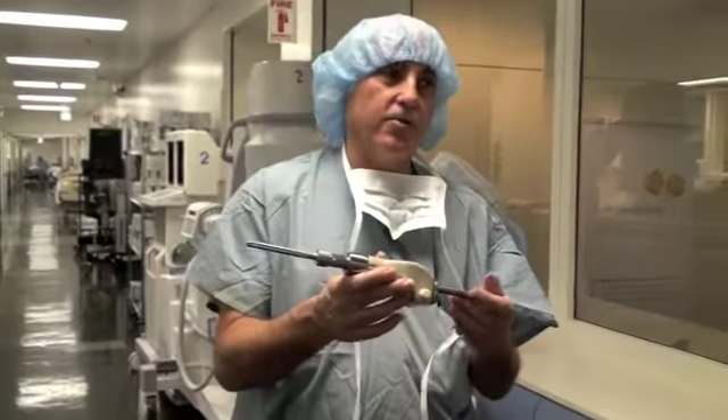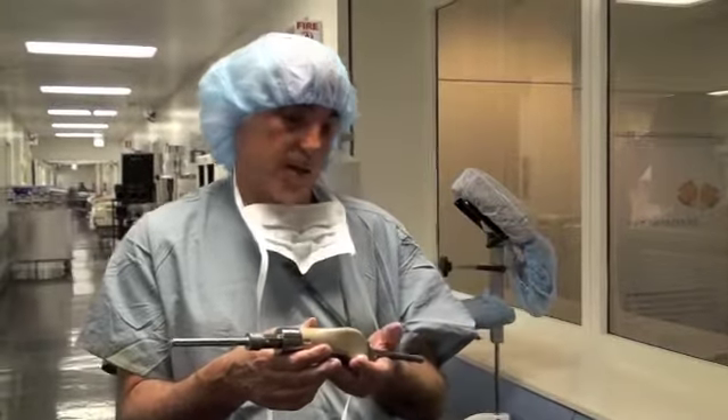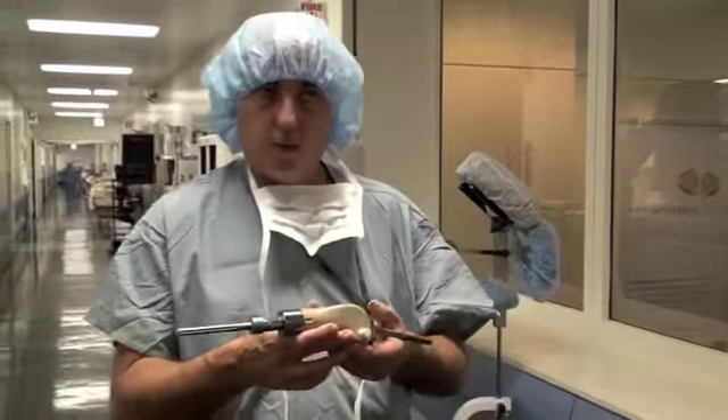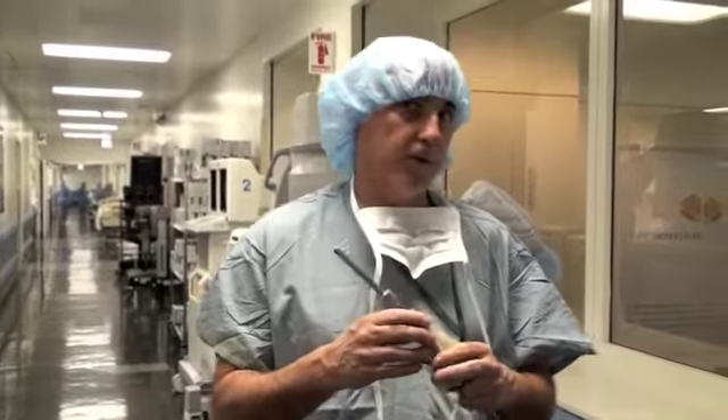This is a pediatric device. It will serve its purpose until he stops growing, and then we put in an adult device, which is more durable, stronger, and more suited to a grown-up individual. It's a very rare operation done for a very rare condition.